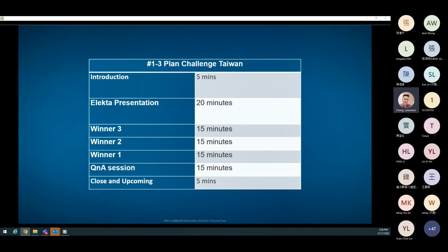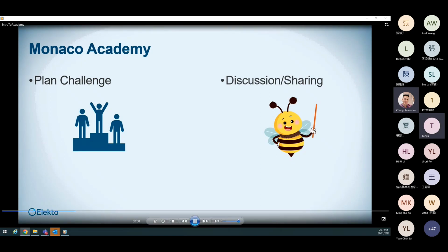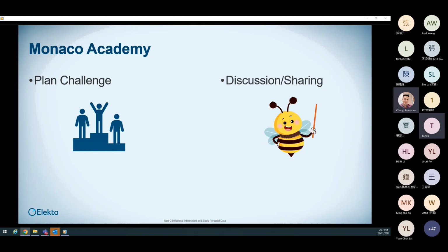And the whole idea is that you'll be able to take away some tips and tricks and skills that you've observed through these 3 presentations. You could potentially take back to your clinical practice and improve on some of your clinical patients. There are also prizes associated with all these as well. So not only is it a plan challenge, but it's also a great opportunity for discussion and sharing.